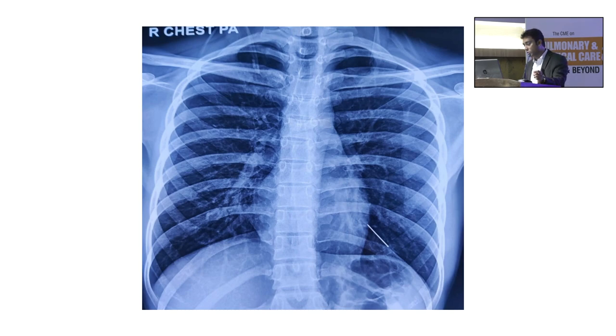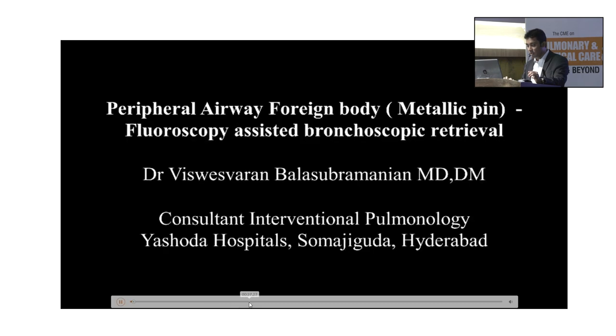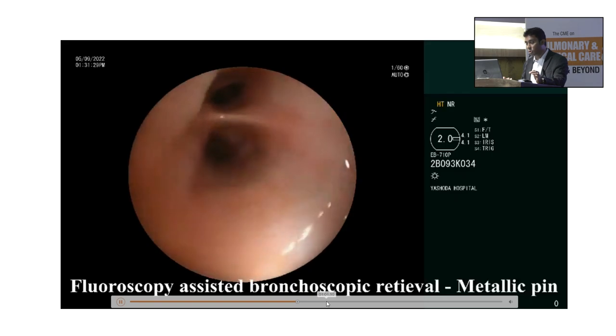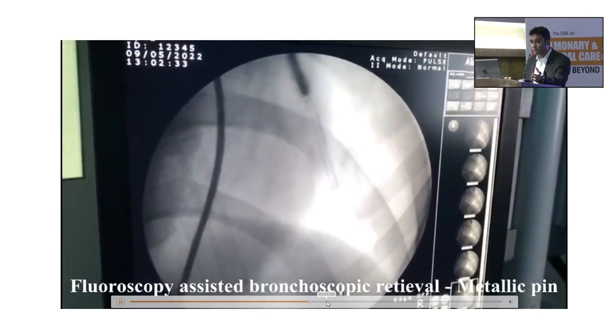So this patient was roaming around like this for 4 to 5 days, and he came all the way from Warangal. And what we did was a bronchoscopic extraction of the foreign body. You can see from here, the challenge in this case was that the foreign body went so distally that you cannot see it with your routine bronchoscopy.